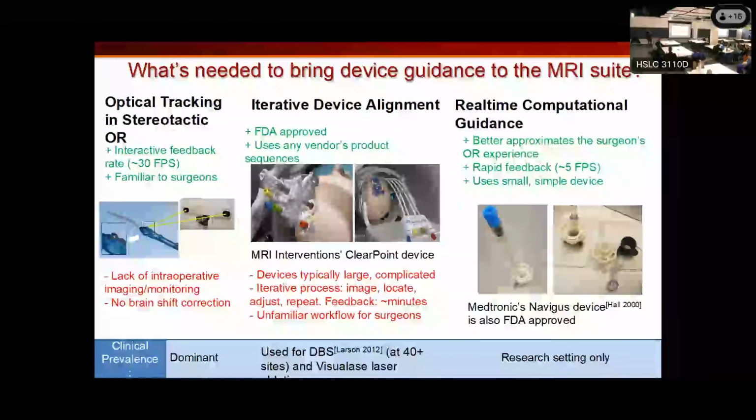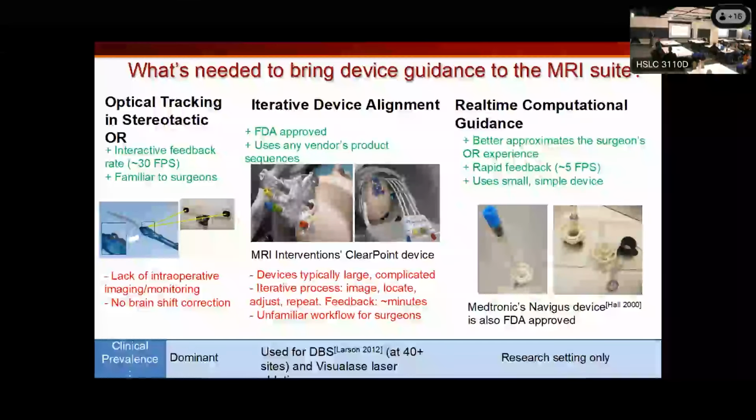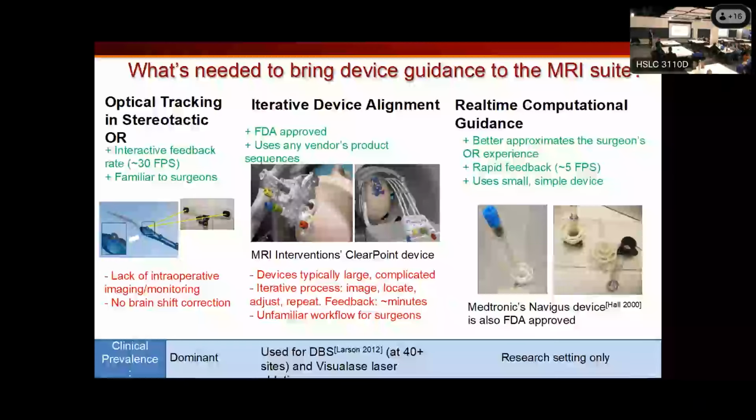But again, what happens in this world is the MRI vendors are going to watch development in the realm of neurosurgery. They're not going to get their hands involved in a company day to day. They're going to see if a market grows enough. If it grows enough, then they'll put more resources into it. Okay, so that's the way these interfaces look the way they do, because they had to develop without any real engineering effort of the MR vendor themselves.